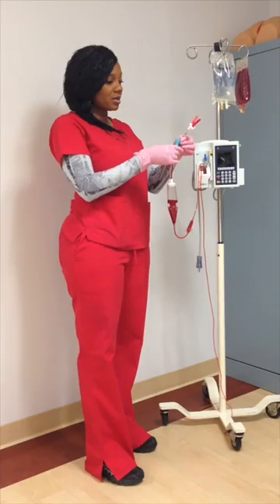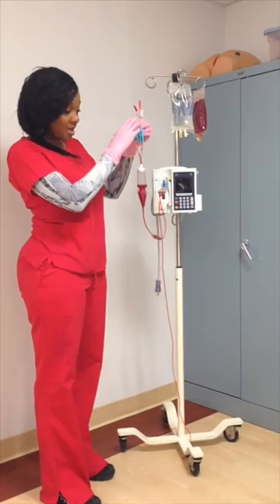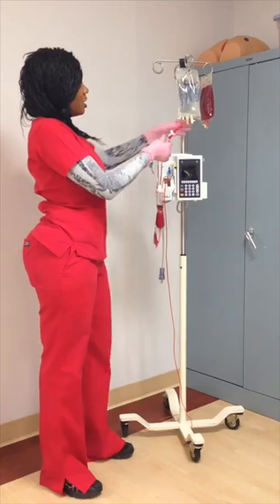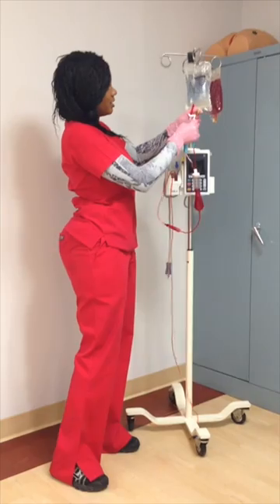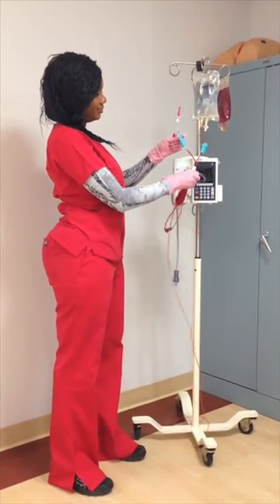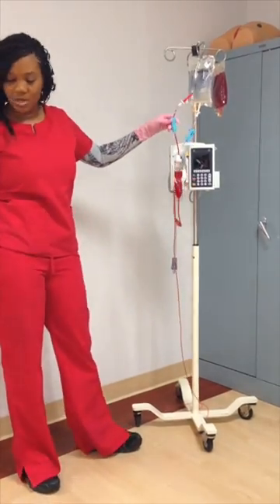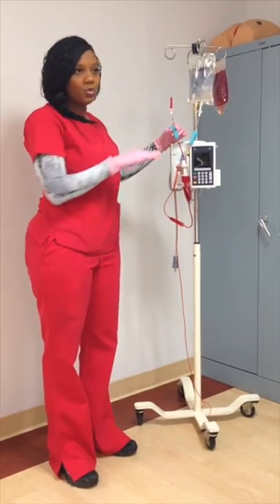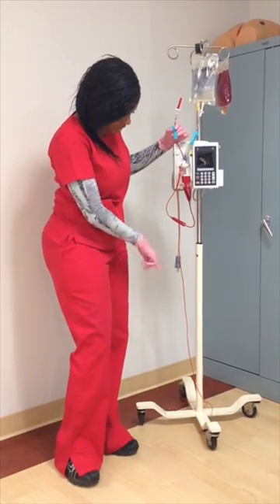At the start of your transfusion, make sure all your tubings are closed off. I have pre-primed this tubing for purposes of time. You will open up your normal saline, spike it, open up your tubing, and squeeze — have a little come down in your chamber. You will prime it like you would any other solution you're going to infuse, all the way down until you get to the end.